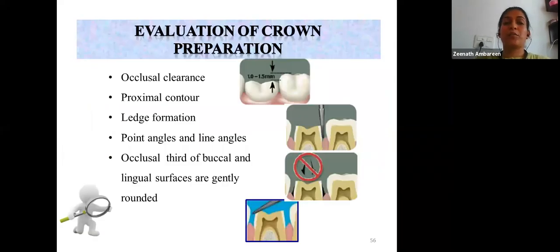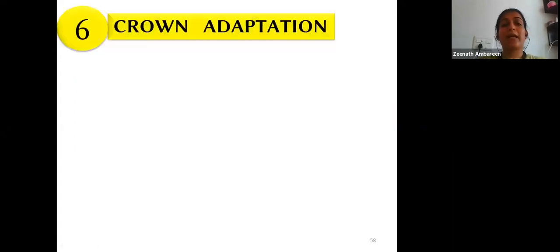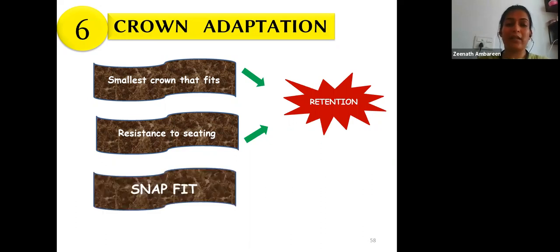Evaluating crown preparation: check that the proximal contour is maintained with no ledge formation, all point and line angles are rounded off, and occlusal clearance is proper. During crown adaptation, the smallest crown that fits onto the prepared tooth is selected; it should exhibit a slight resistance to seating for retention and should snap-fit into position with a clicking sound when seated.